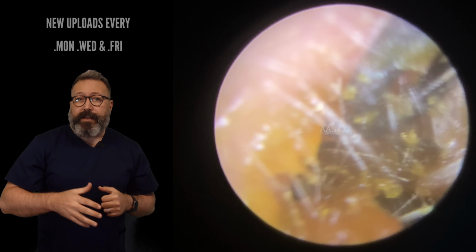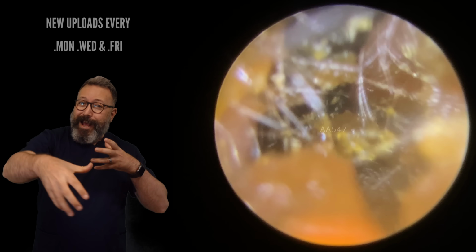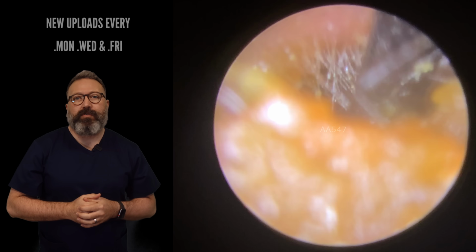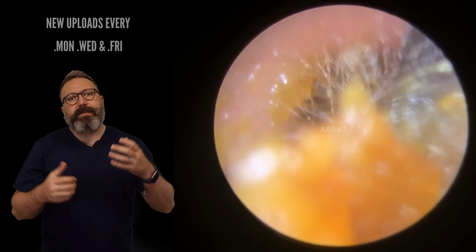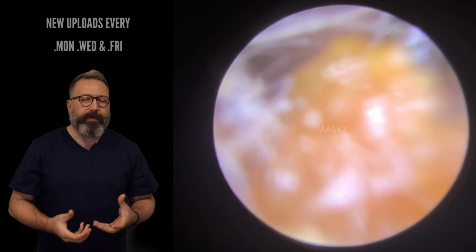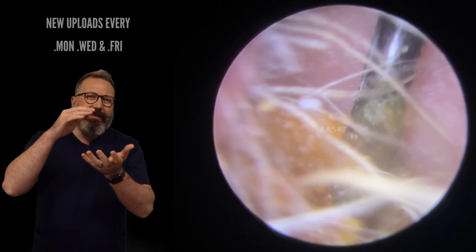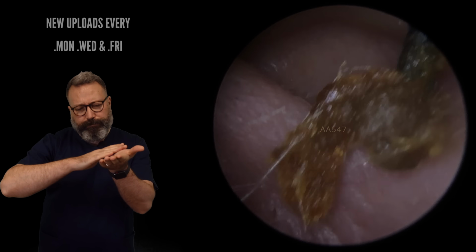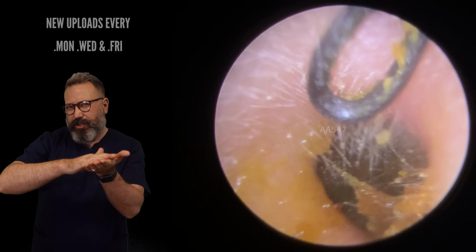So we're just bringing this next section, I couldn't remember to breathe, sorry. You've got to bring this next section forwards here. There we are, sticking with the Jobson horn for the time being. With this particular type of consistency of wax, I do tend to stick with the Jobson horn for quite a bit. It's only really when we get to a very thin layer that's left on the actual ear canal wall, I tend to switch up to a suction tube.